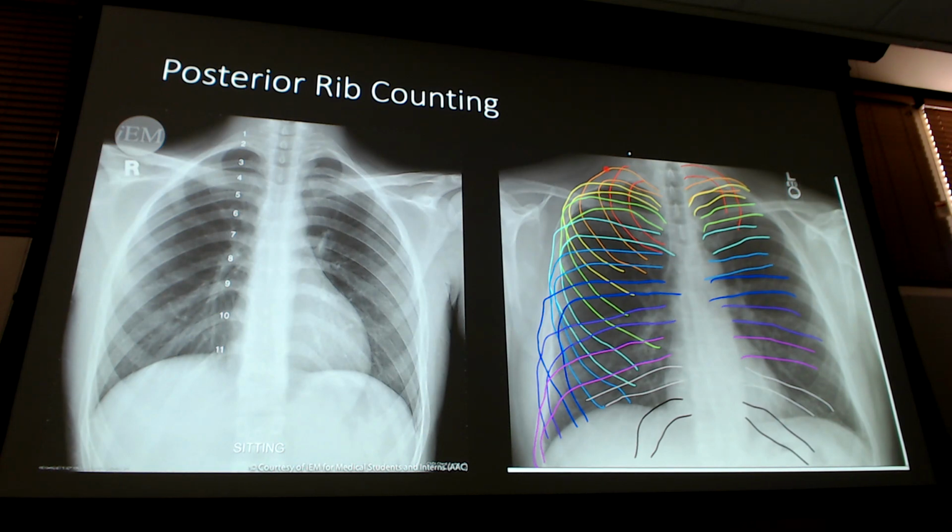So how the heck would I know? Easy. They're going to flip it the way it's supposed to look, and your left marker is going to be on the side with that little itty bitty right atrium, because everything's the opposite. But you won't have to worry about that, because this isn't something that magically gets found later in life. Usually they go to doctor's appointments with their kids. They get well visits. This gets found early.